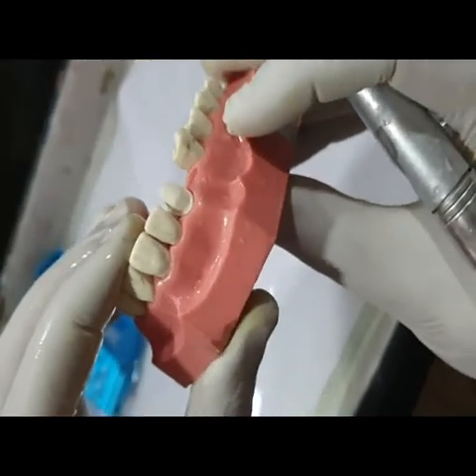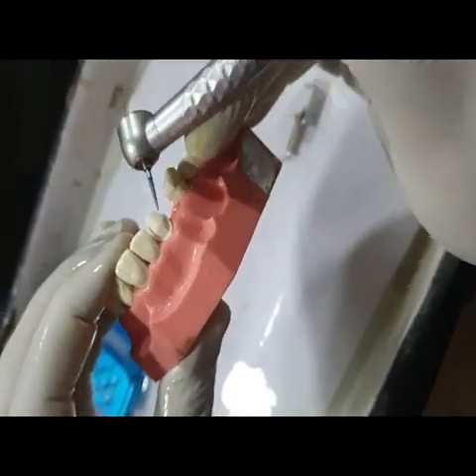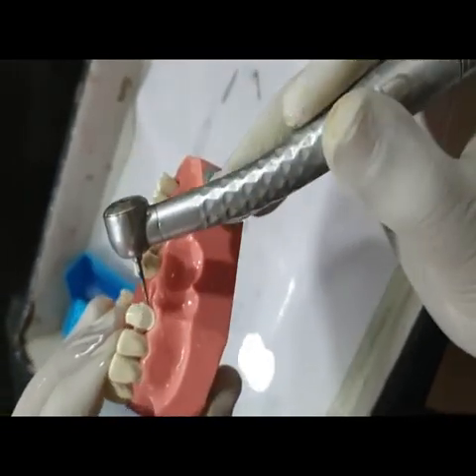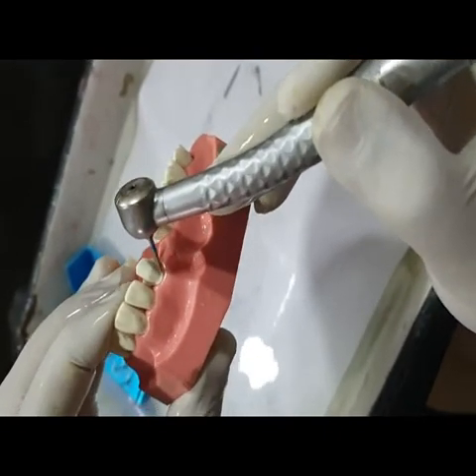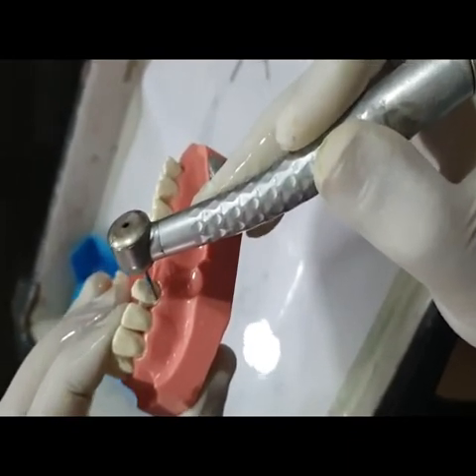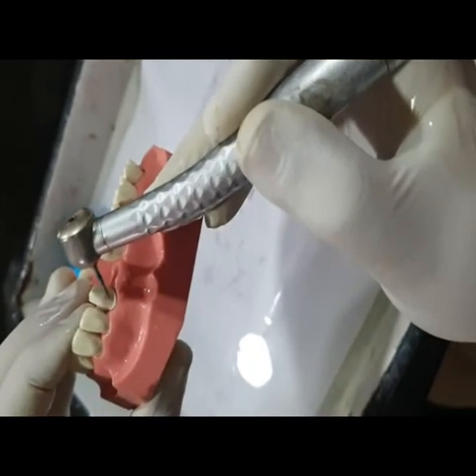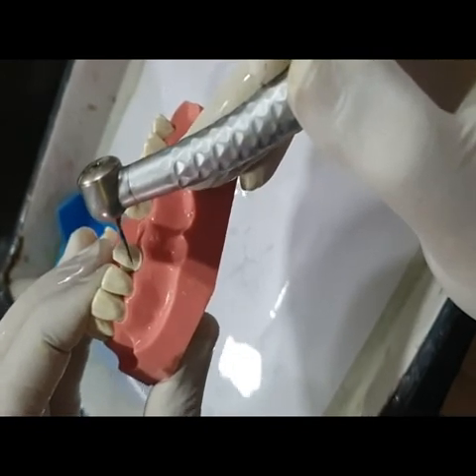In this video, in continuation to the last video, you can appreciate the biplanar reduction which has happened — you can see the two planes in which we have done the incisal labial reduction of the canine. Also, one more thing to appreciate is the clarity of the margin. The margin runs from one end to the other at a 90-degree angle to the prepared tooth structure. On the labial side, we have tried to make a shoulder margin so that it can support the extra bulk of material required as per the aesthetic requirements of the patient.